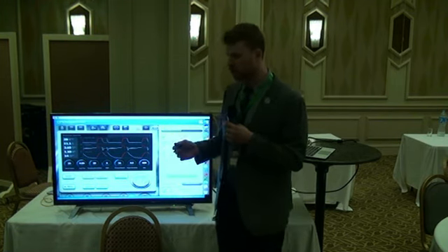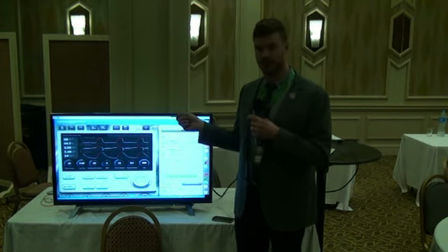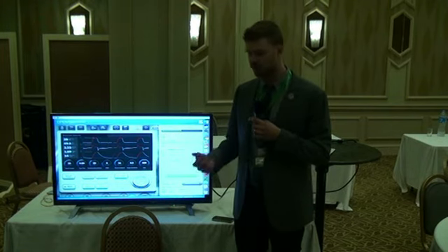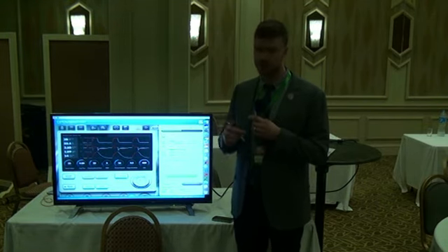I think that for a long time we actually did suctioning just like this, just like you guys. That's why we made that animation look like that, because that was our practice when we were first starting to build this whole thing. But what we found was there was increasing literature. We didn't really have that high of infection rates, to be honest, and I think that's really a function of the diligence of our clinicians.